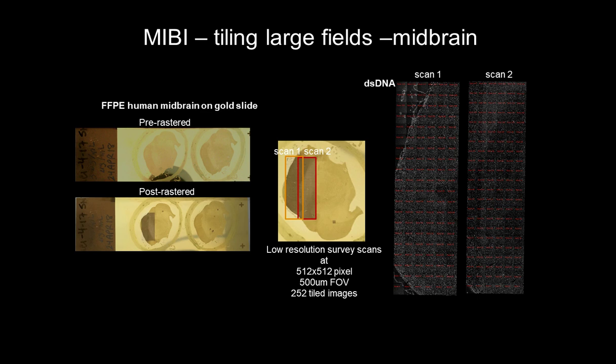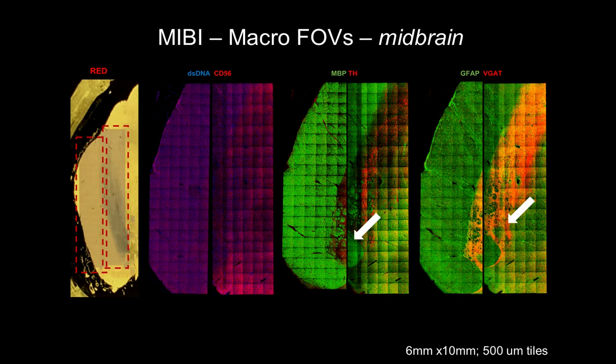So what happens when we start overlaying our markers? Well, there's multiple levels to organization in the brain in particular that I think is even more interesting than tumor immunology. So we're going to start here with this macro view, and there are some things to pay attention to. When you're judging overall neurophenotypic status over a large area, understanding the patterns and restriction of marker expression is a nice thing for validation, comparing region A versus region B.